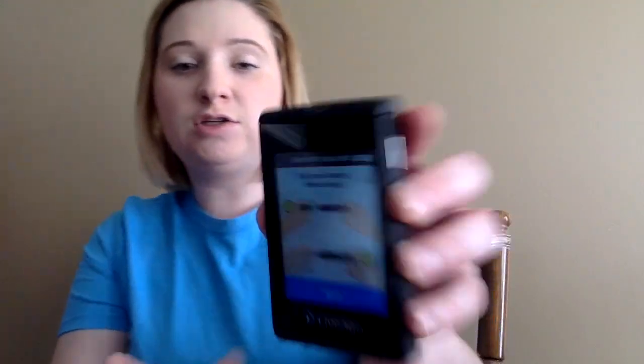Okay, anyways, going back. So it's get your lancing device ready. So let me use an alcohol swab. Actually, my mom got it for me. They went to Sam's and they got the Member's Mark brand of alcohol swabs. And my gosh, it has lasted me so long. I'm still using them, and they probably got it for me like a month ago, if not longer. But then again, I don't really check my sugar that much. Okay, so wipe my finger off. We're going to hit next.